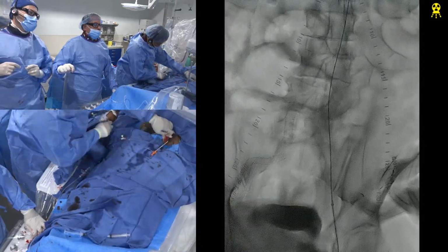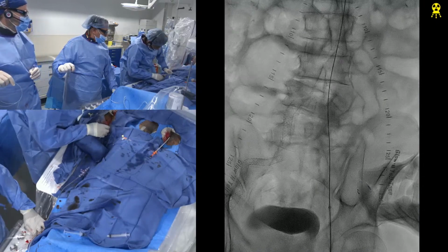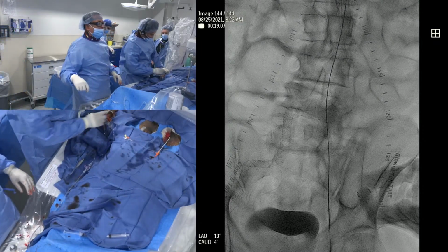Just to about 25. Well, what happened now? He's doing the same thing again here. You pulled it out again? Yeah, luckily I have the loop. Yeah, here. So it's good. It's good. It's all good. All right, all right. It's good.